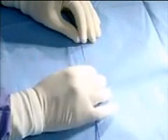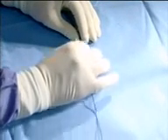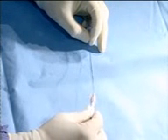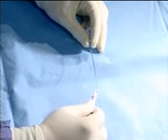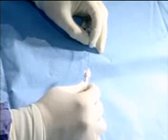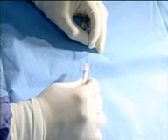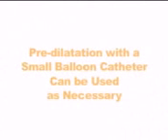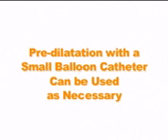When advancing the device through the guide catheter or guide sheath, advance both the protection wire and the EZ delivery sheath together. When navigating the vasculature, use a 2-handed technique, advancing the delivery sheath with one hand and torquing the wire with the other. To prevent inadvertent filter deployment, do not push the wire as you are torquing it. If the lesion is difficult to cross, consider using a buddy wire technique. Pre-dilatation with a small balloon catheter can be used as necessary.